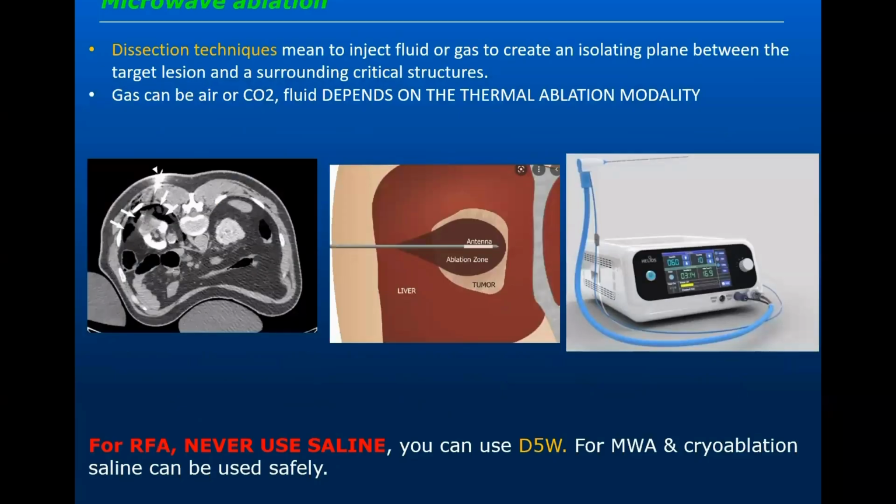So this is the slide that I wanted to show you guys, and I wanted to start from this one. If you have your tumor here and your needle, the challenge with microwave ablation is that it likes to grow like this. It likes to cause what we call the teardrop appearance. Now, with the advances of modalities and techniques, they are starting to make it more spherical, but the classic teaching is it's like this. So if you are doing ablation, you really need to make sure that this is not growing back to burn anything that you don't want to burn here.